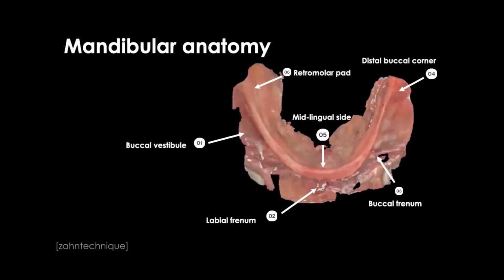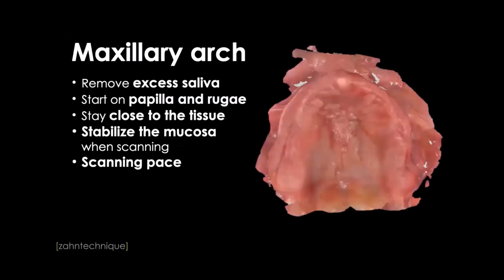And I would say, please remember to capture as many landmarks as you possibly can with a scan, because we treat the digital impression as the same as analog. So the more information you give us, the better. Great. And we're going to show in a slide later what we are doing next, after we scan the edentulous arch, and why we need these landmarks. So bear with me a couple of slides.